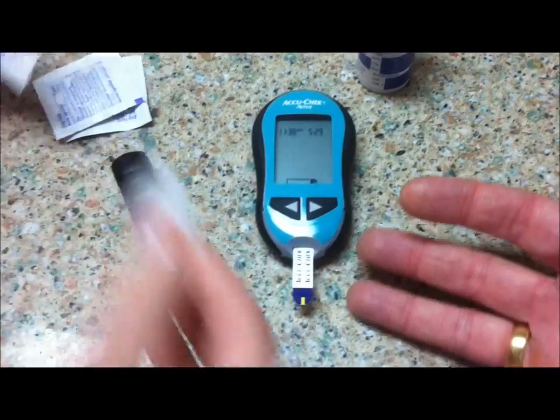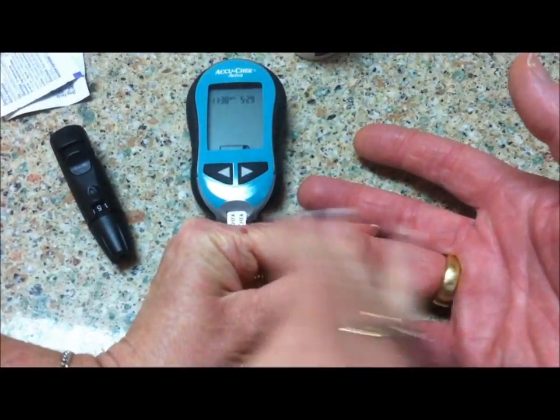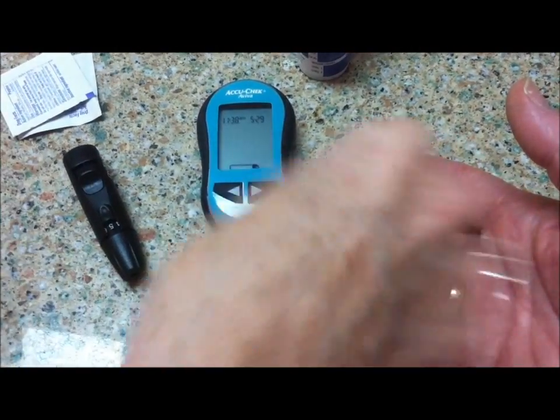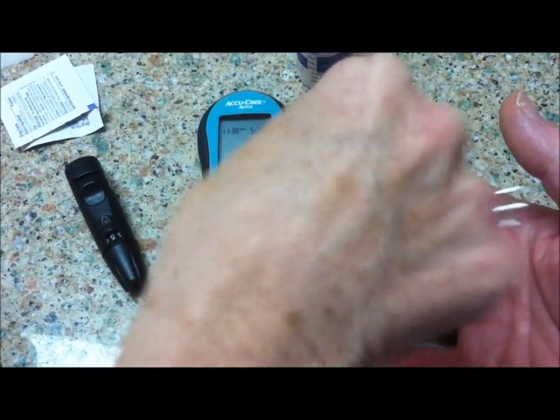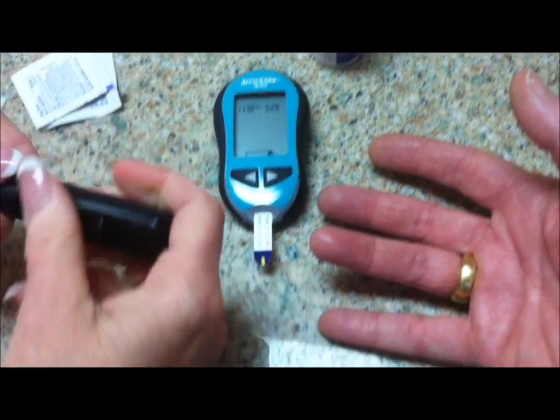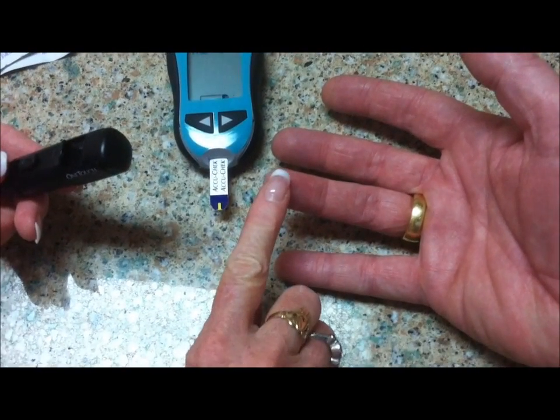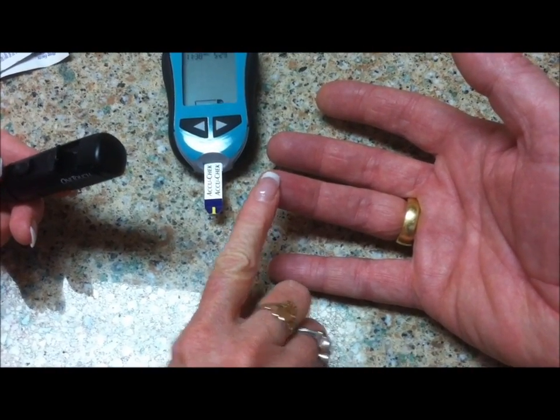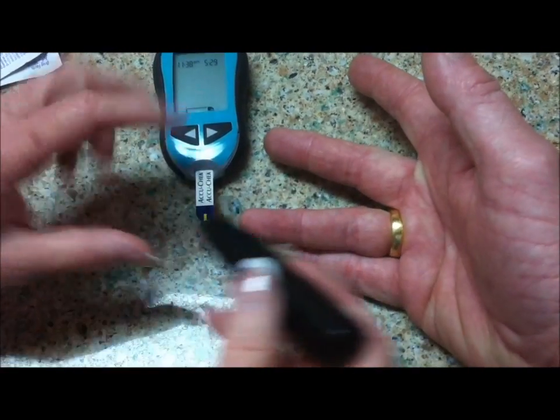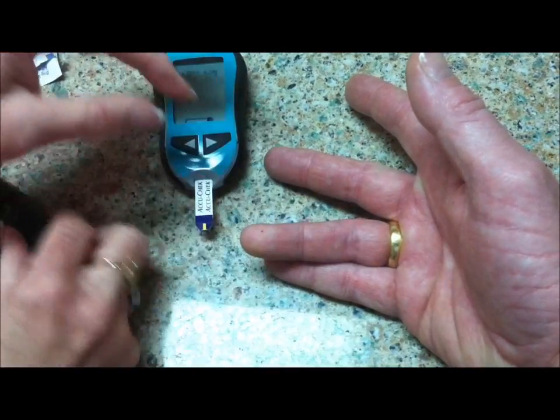We're going to clean the finger with alcohol, and we're going to wait for that to dry. You can use the poker of your choice. Remember that nerve endings go right down the middle of the finger — this is also where the pad of the finger is, where you touch things. So if you tend to poke on the sides, you'll get a good blood sample.